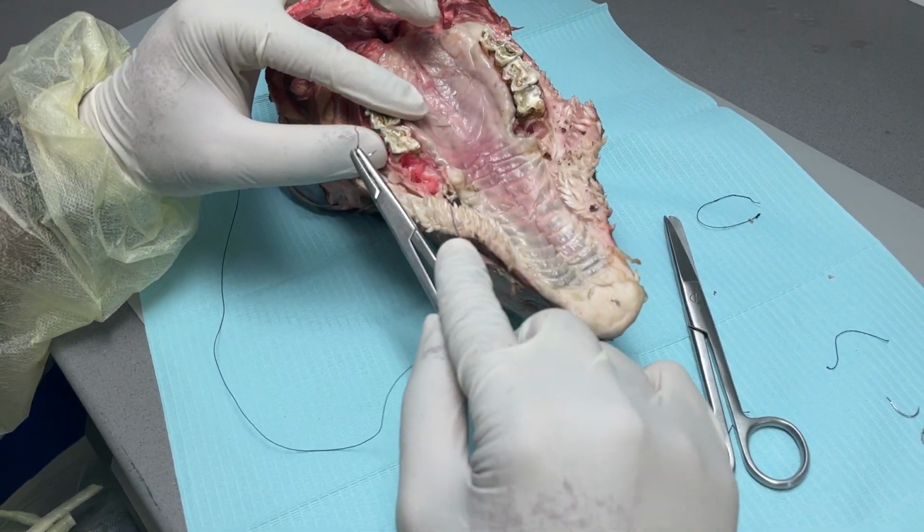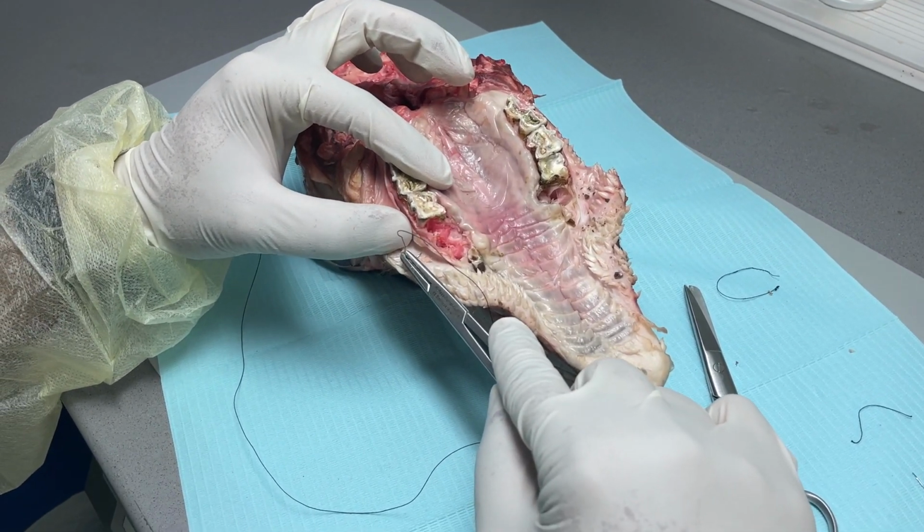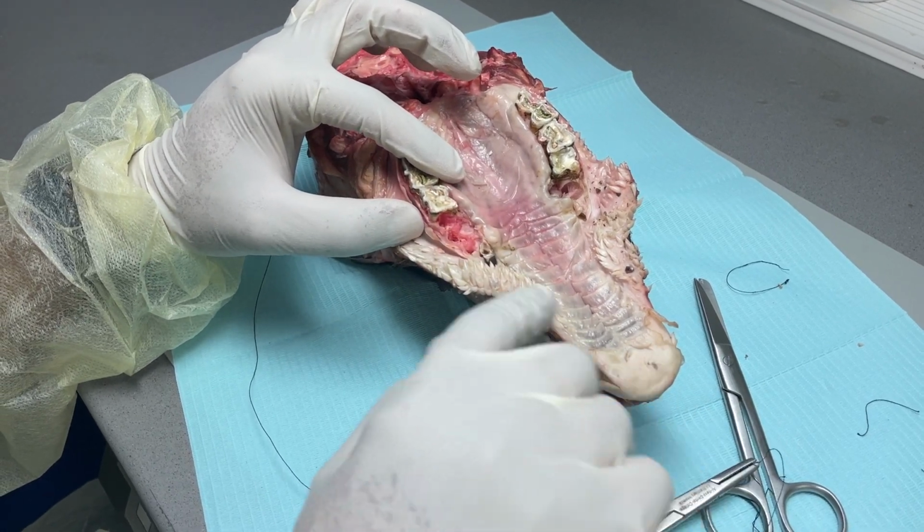So this is horizontal mattress. Just imagine making a box.